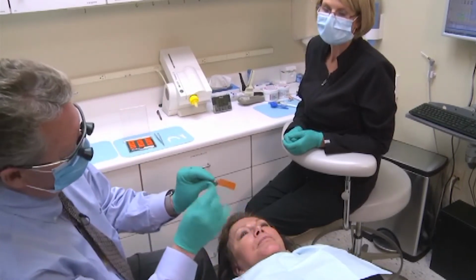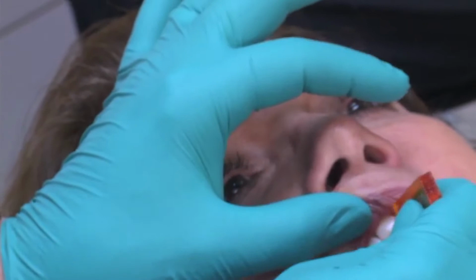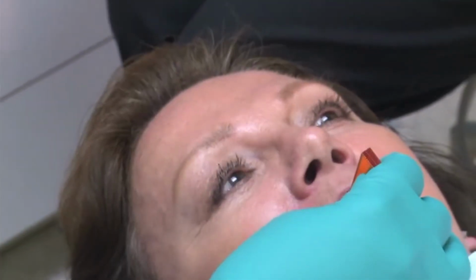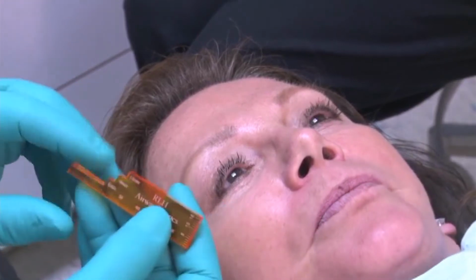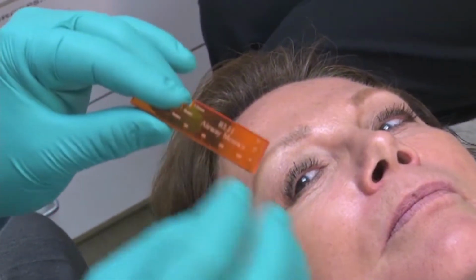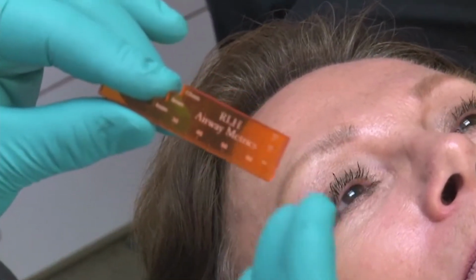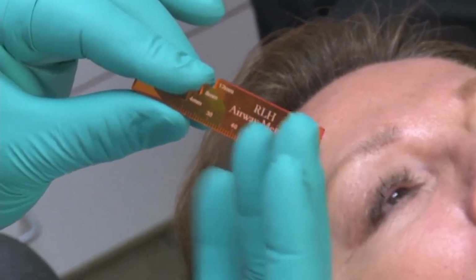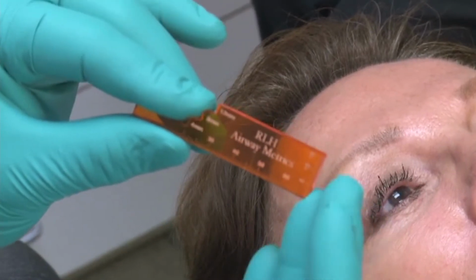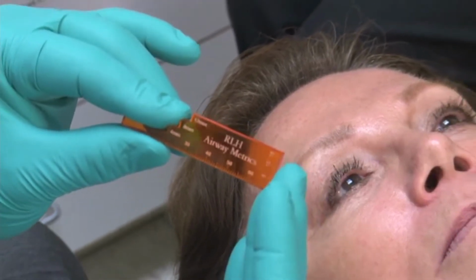So we're going to go to our next step, which would be 8 millimeters of vertical. Close. Now try that. Better, right? We're still hearing a little bit of noise. And open. I don't like to go to 12. 12 millimeters is a lot of vertical. Remember, we want to encourage nasal breathing. If you look at the literature, there is documentation that mouth breathers have a more severe AHI than those that are nasal breathers.